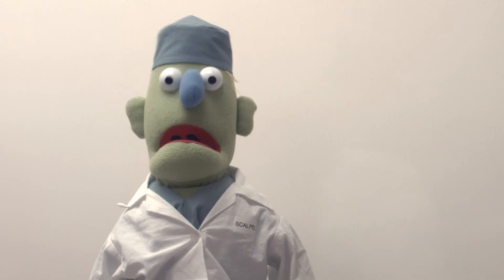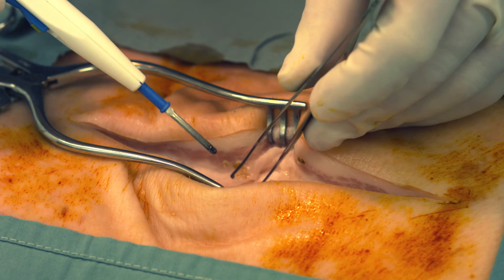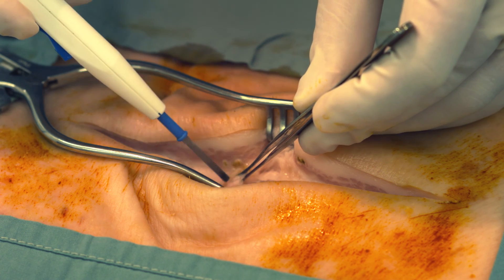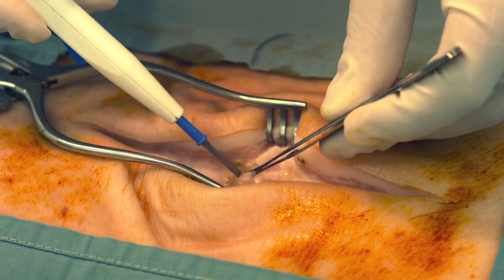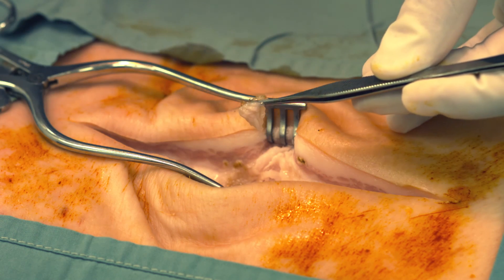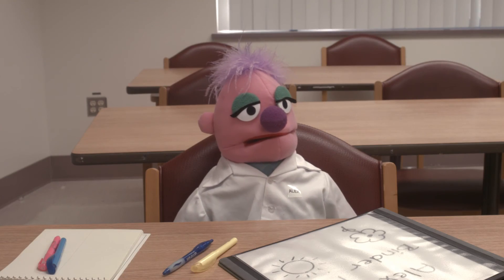We can use the coagulate button to seal off pesky little blood vessels in our incision. We usually grab them with a forcep, and then apply the cautery to the forcep to cook them good. It doesn't matter where on the instrument you put the cautery — the current shoots right down to the tip, so just touch it on the top of the forcep. If you get tired using the scalpel, you can use the cut button on the cautery to do the same job, and if you get a little bleeding, you can zap it right away with the coagulate button.